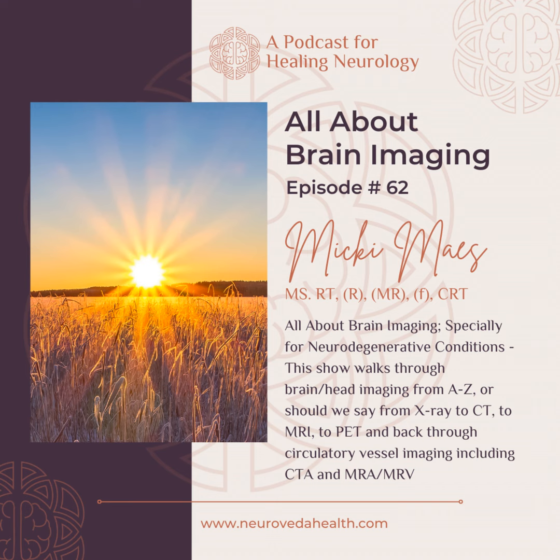What's next? Next up would be CT. Now, CT is computed tomography, and that's a structural imaging method that also uses X-ray, but we take the X-rays in a sort of tomographic or slice by slice way, and then reconstruct the images in different planes.